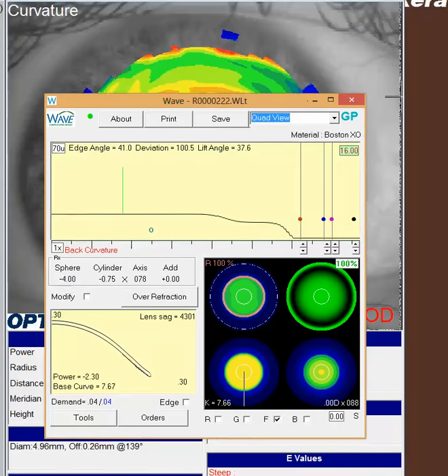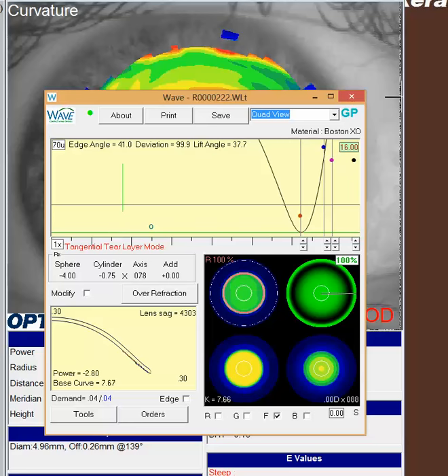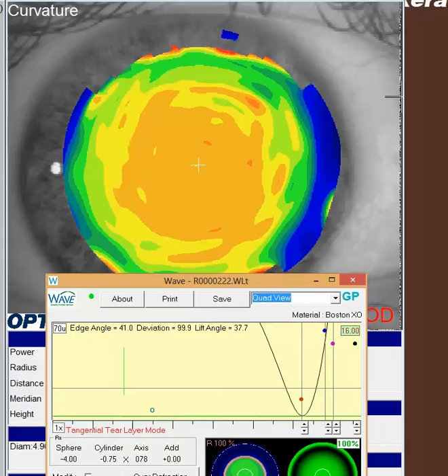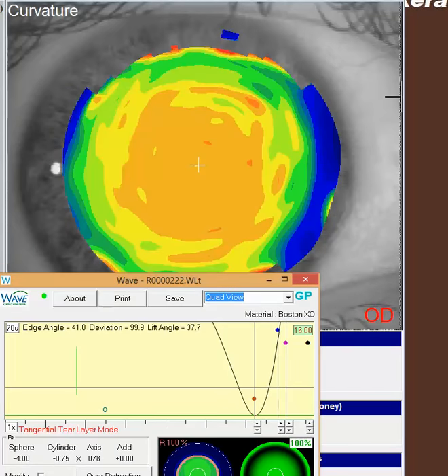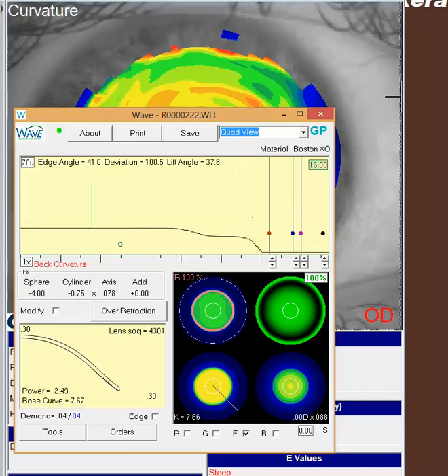In a scleral design like you have, you're vaulting the cornea, and you would intuitively think that the tear film would neutralize any distortions in this cornea. But as you know, working with corneas throughout your career, quite often these rules go out the window and they're not always so hard and fast. So one approach is to assume the tear film will neutralize any corneal difficulty there, and one way to do that is just try to make this area a little bit larger.